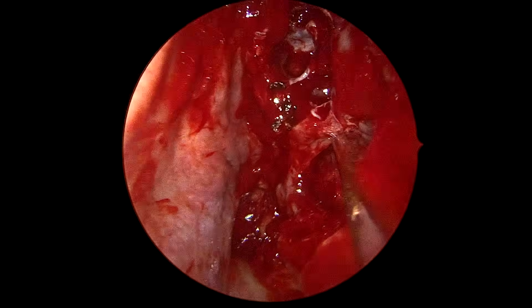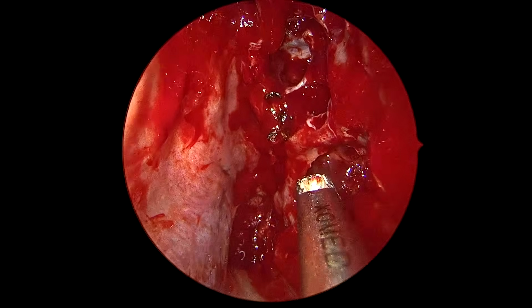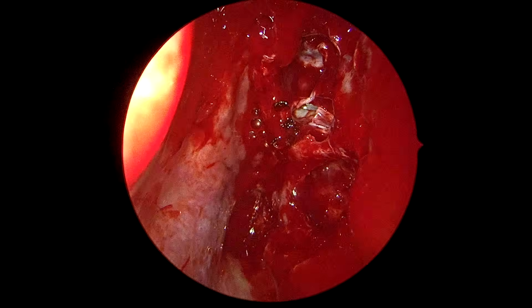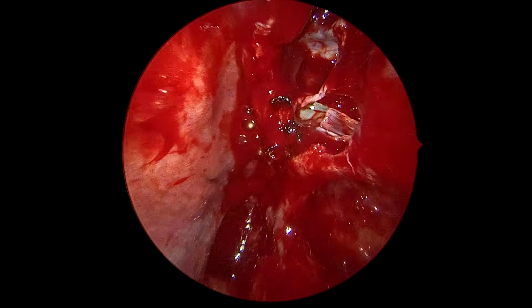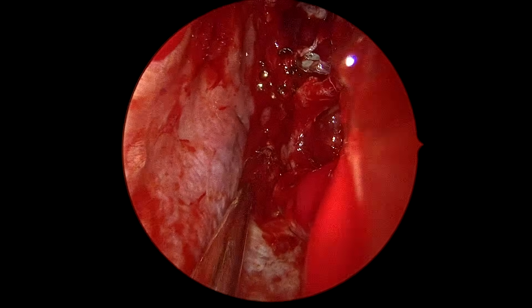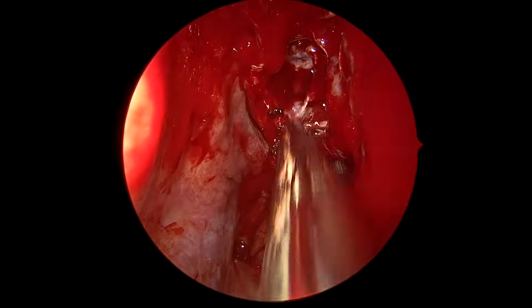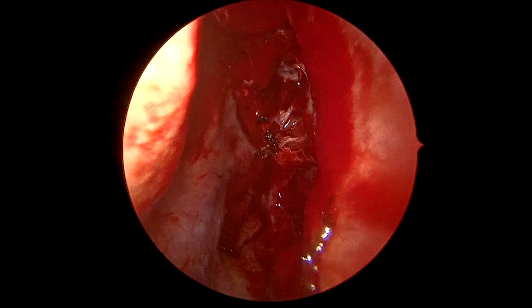This is again some widening of the maxillary sinus. So this part looks clear to me. See the nasal patency, I can reach directly to the choana with the help of suction. After inferior turbinoplasty especially, it has made a huge difference. The mass is also completely gone.